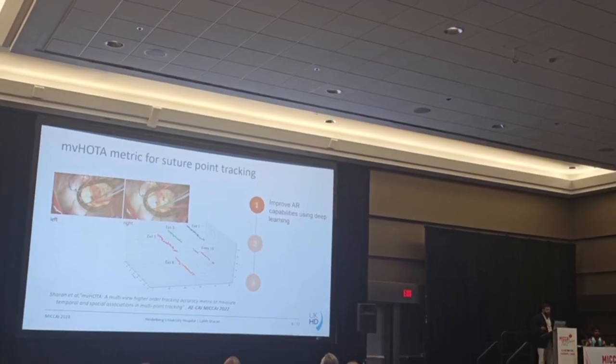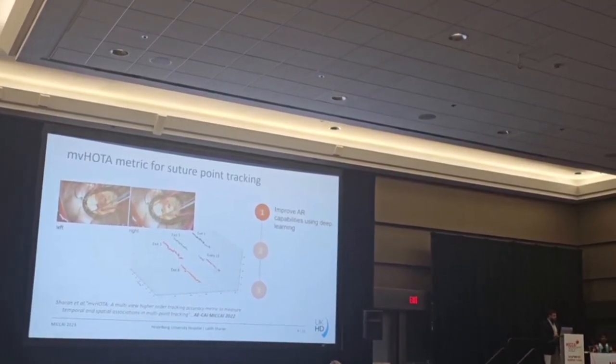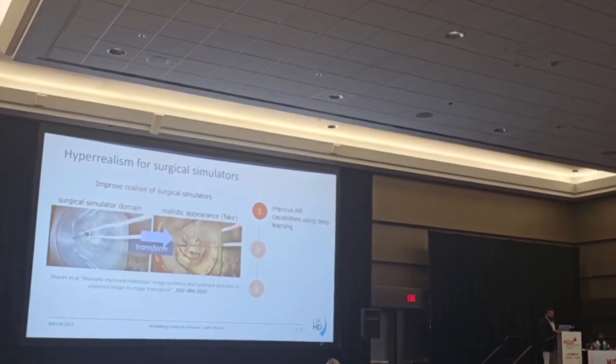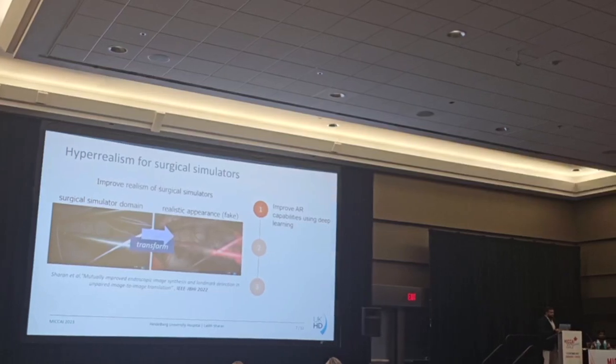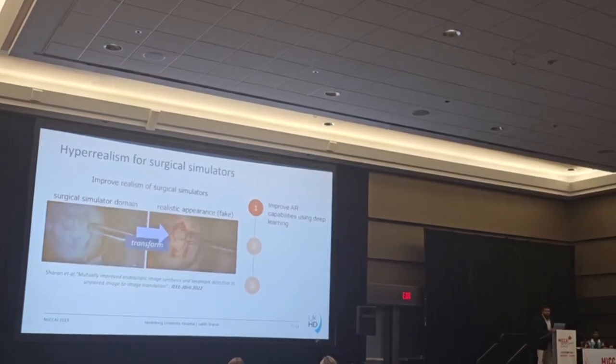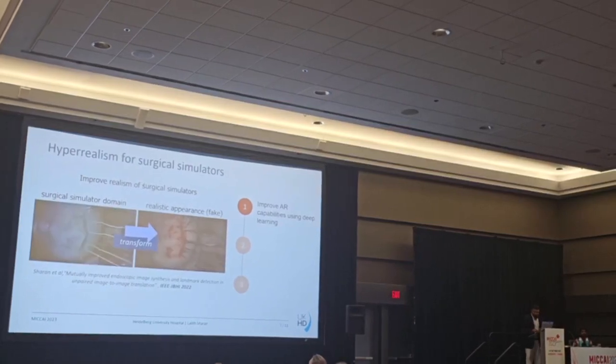So now that we have endoscopic data from both the domains, another task we can define is to make the simulator more realistic. So it appears more realistic if we can translate the images that we see on the simulator to make it look like the real valve.